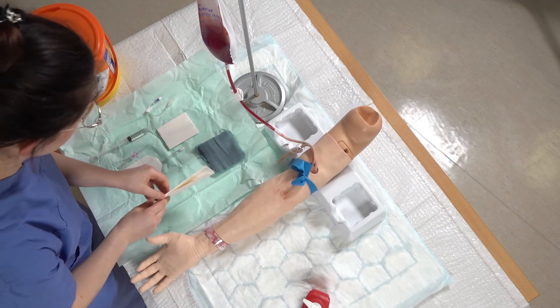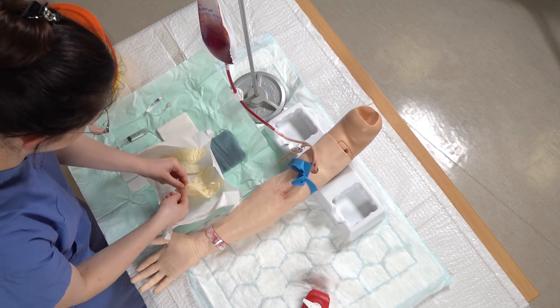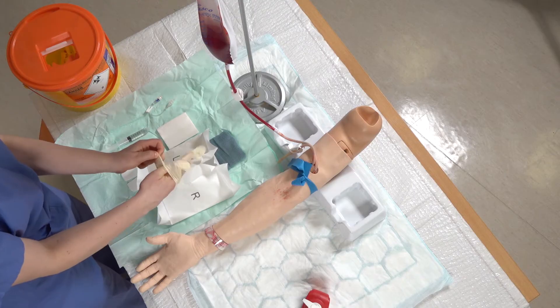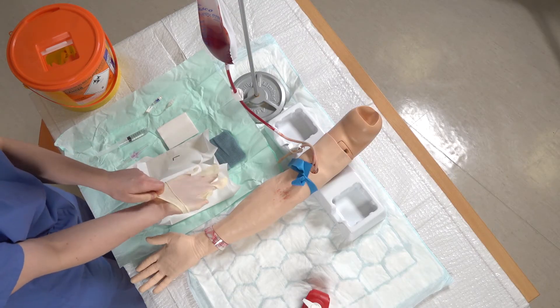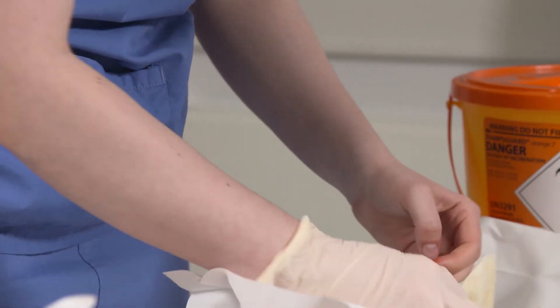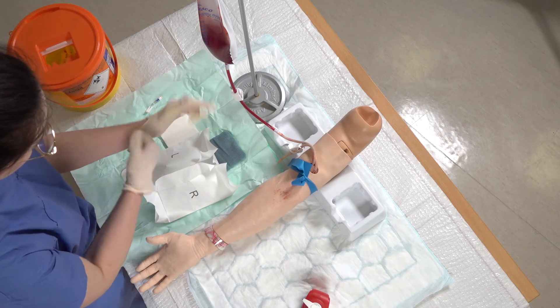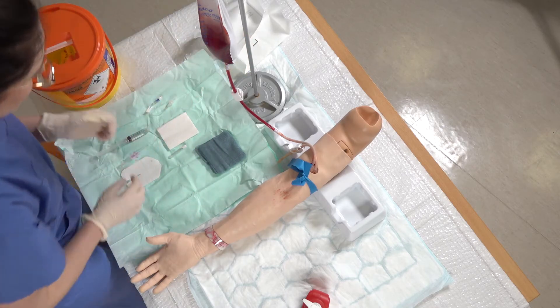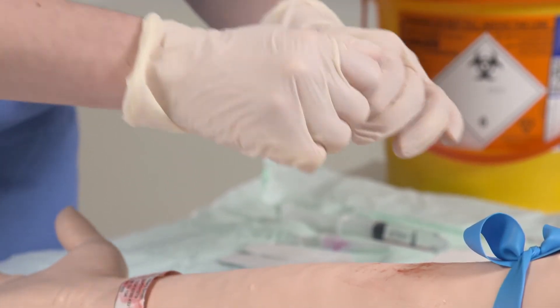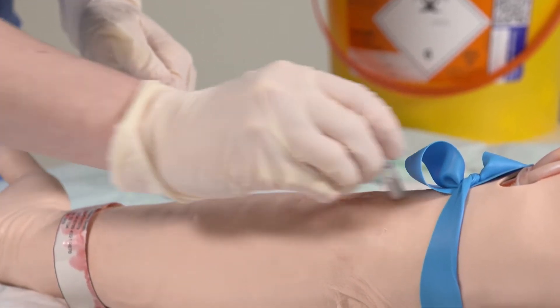The first thing I'm going to do is put my sterile gloves on. So the next thing I've got is my chloroprep disinfectant fluid, so just snap that and then clean the area where I'm going to put the cannula.